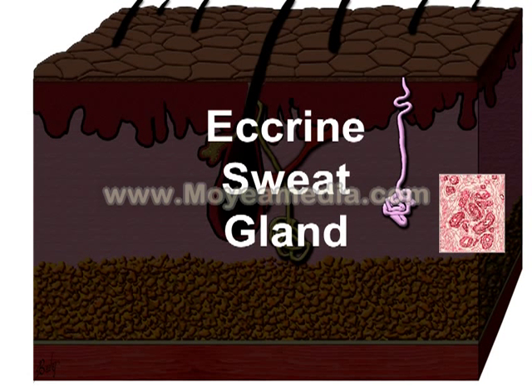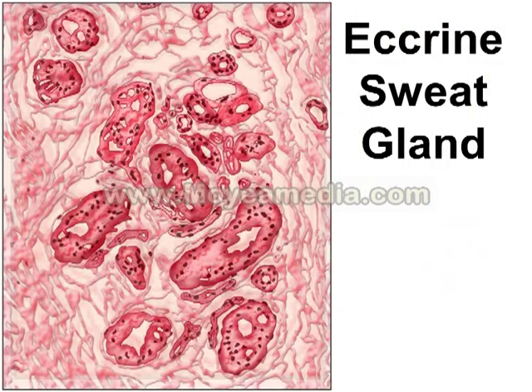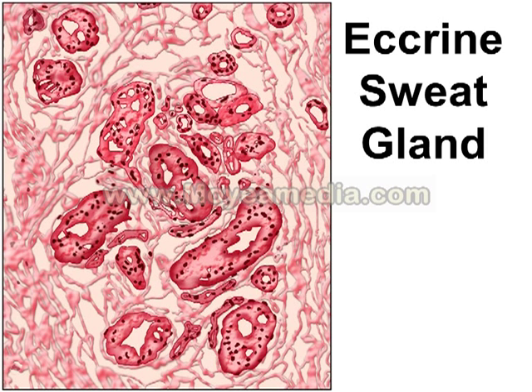The eccrine sweat gland has a lower coil, a straight segment of the duct, and then a curled, coiled intraepidermal acrosyringium. The coil of the secretory unit sits often surrounded by fatty tissue within the deep dermis.